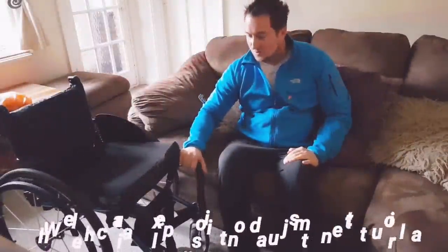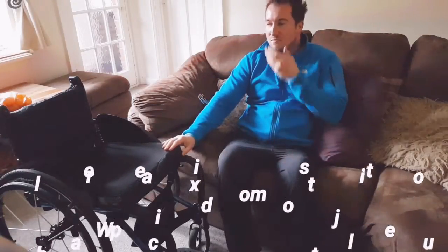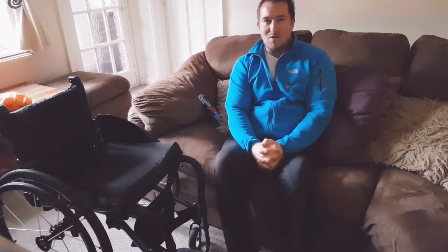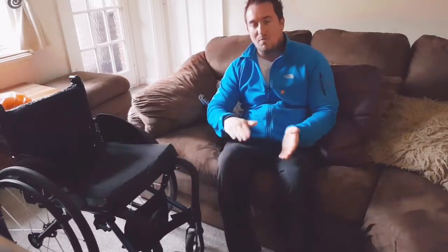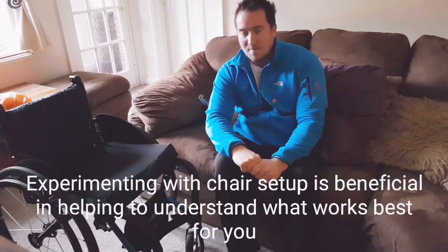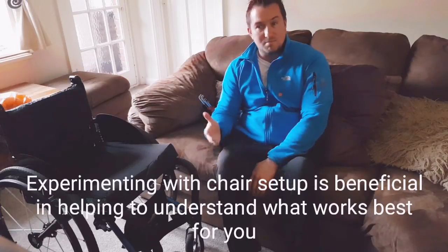Hey guys, Sam again. Just wanted today to adjust my wheelchair for tippiness. It's something I've been changing and experimenting with recently. I didn't realize quite how stable I had the chair set up, so it was quite a lot of hard work to lift the casters up. Having sat in a couple of new chairs recently, I realized it might be beneficial for me to start moving towards more of an active chair.